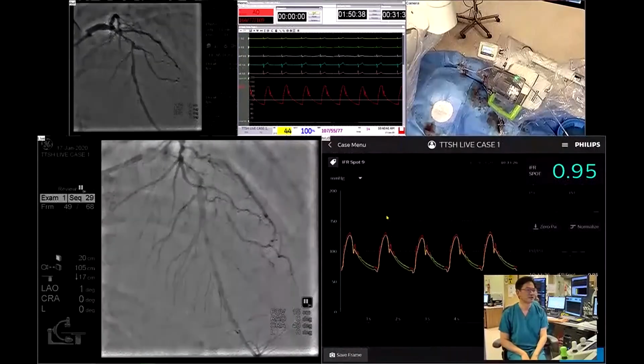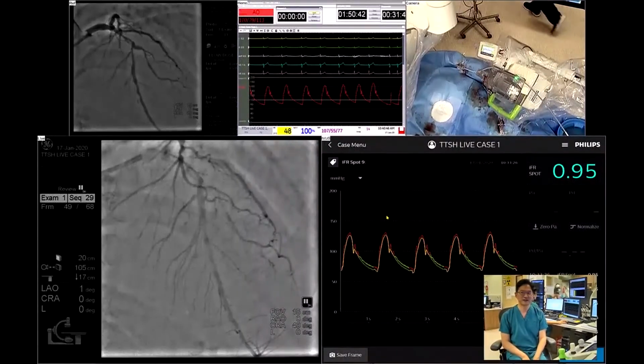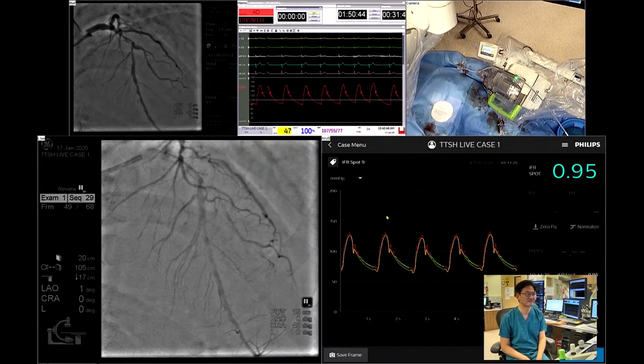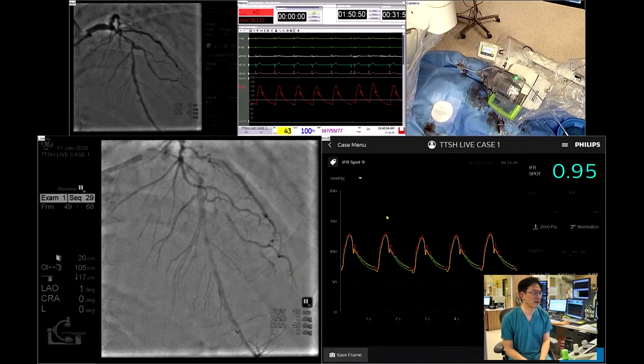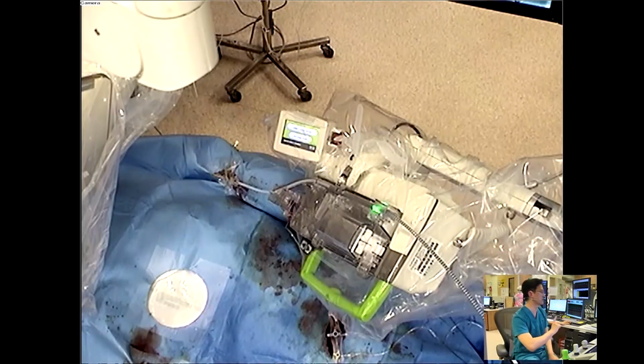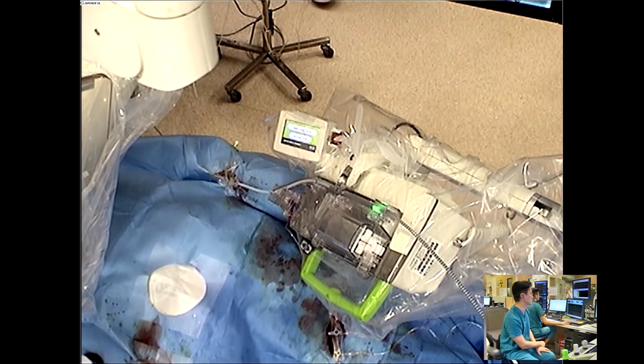Thank you, Paul. So can you see the big screen that I'm looking at? Okay, can you see the final iFR? Impressive. 0.95. Okay, so I think I'm done. All right. So what I want to do finally before I log off is I want you to see what Deborah does. You know, in case somewhere along the line you want to stop the case and take over.